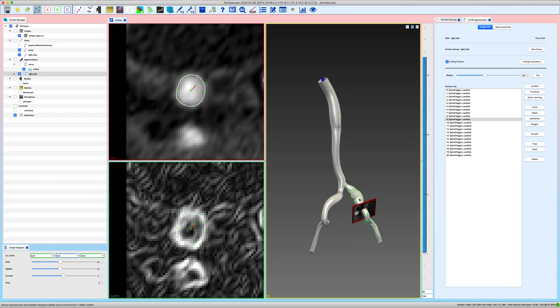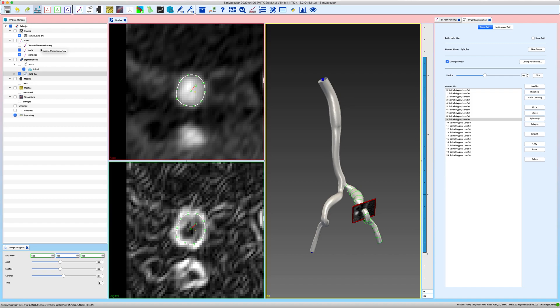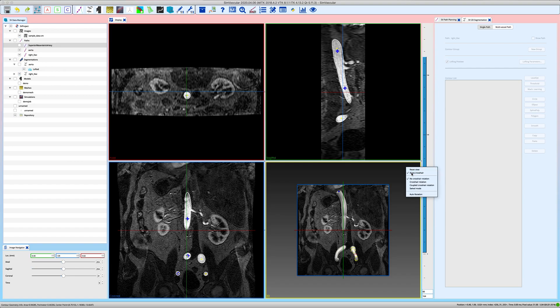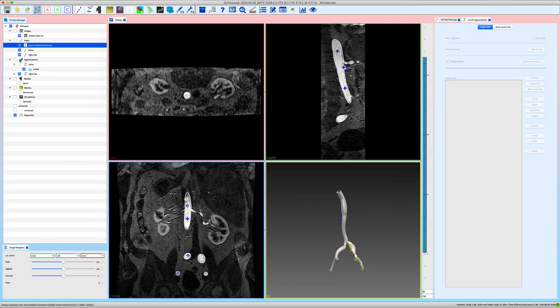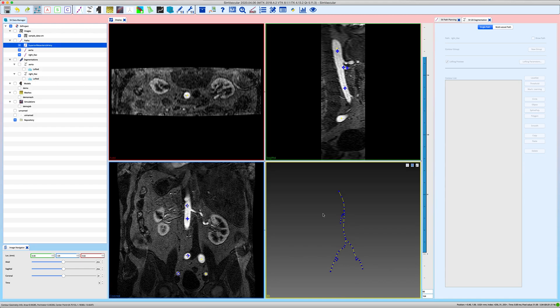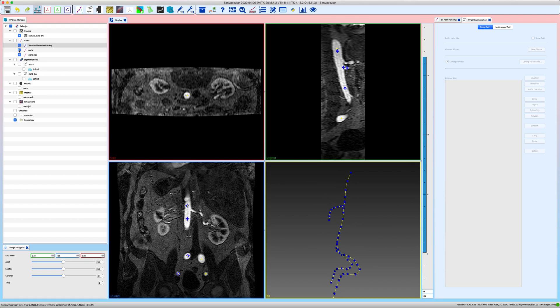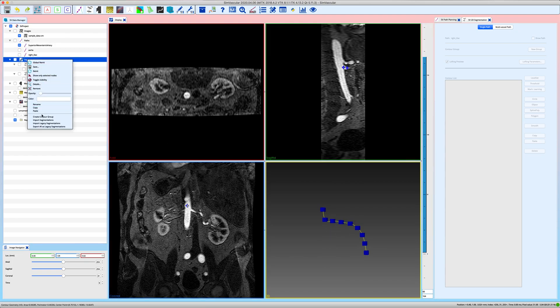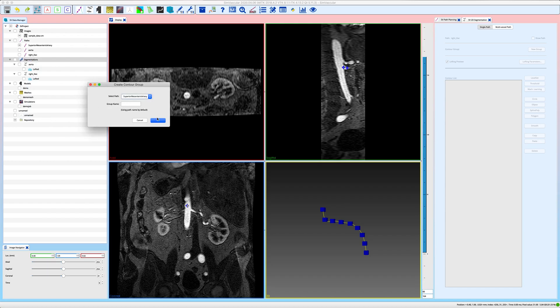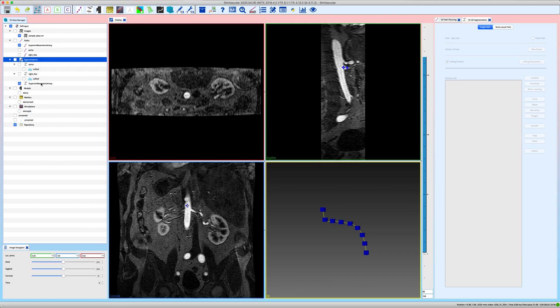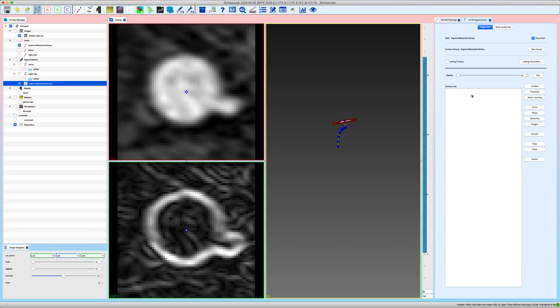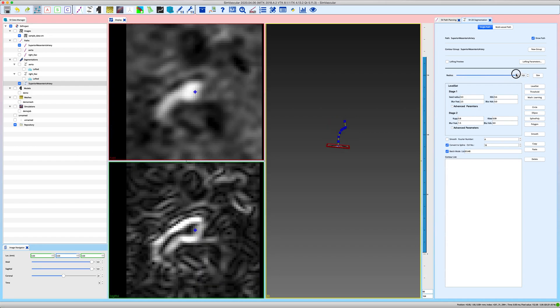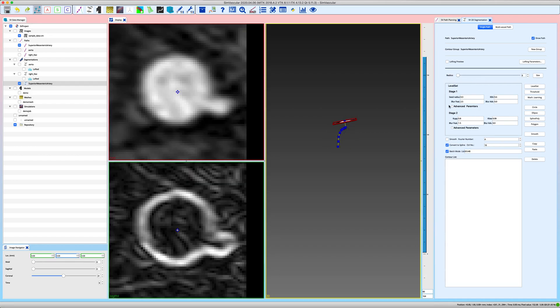And one last thing I wanted to mention is that it's important to not have overlapping segmentations. To demonstrate that I'm gonna use the example of the superior mesenteric artery. So I will create, let me first show you how the path looks like. There we go. So this here is the superior mesenteric artery and just so you see how bent the path line is at the beginning. This will help me create overlapping segmentations. That's why I made it like this. So I create a contour group from that path. And let me just use the level setting method in batch mode, convert to spline. Let's go to slice number 40. All in all this path has just over a hundred slices.